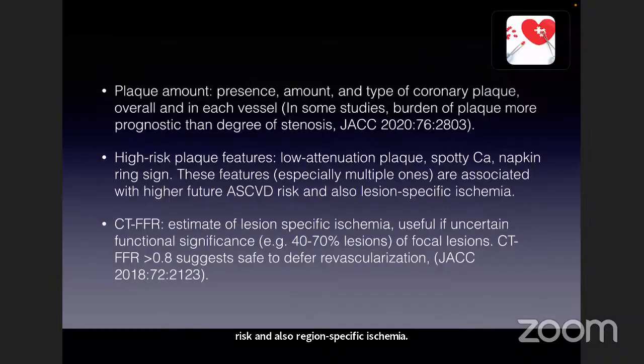CT-FFR estimates lesion-specific ischemia, useful for uncertain functional significance, from 40 to 70% lesion. CT-FFR more than 0.8 is suggestive to defer revascularization.